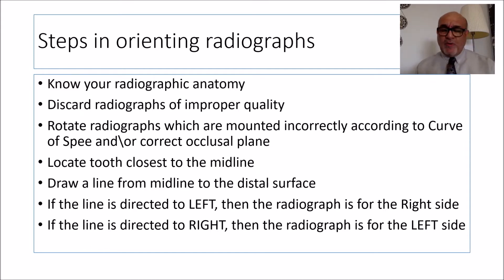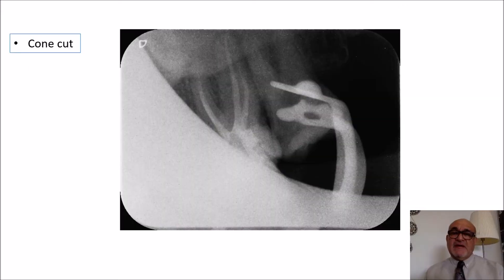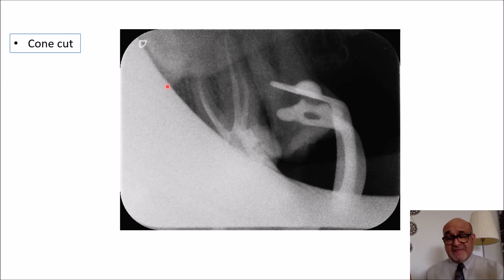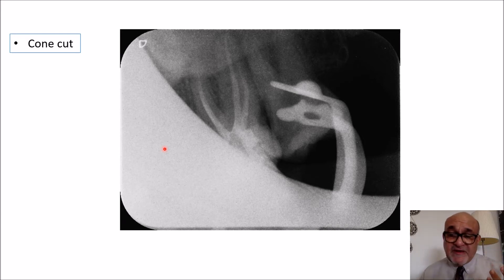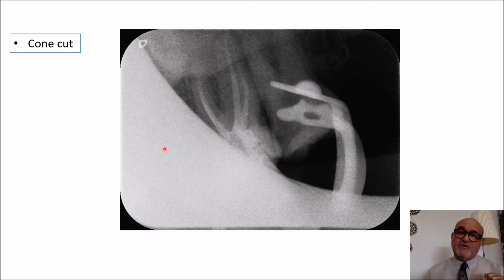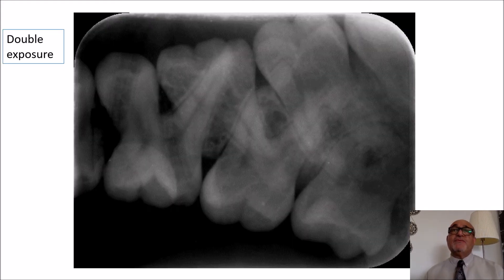A radiograph like this one with a severe cone cut — as you can see — has no diagnostic value. If you're looking for the apex of a premolar here, there is no point in orienting this radiograph. It is better to avoid this from the beginning. Always use a sensor holder and direct your beam properly to avoid ending up with a cone cut like this case.